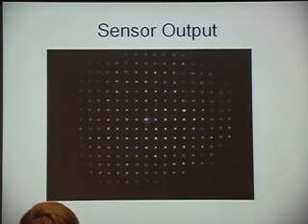So this is an example of kind of an image from a person's eye. You go in there and measure it. You can see a spot from each one of the cameras, and hidden somewhere in that positional information, where the spot is, is information about the person's eye. There's a few other things in there too.